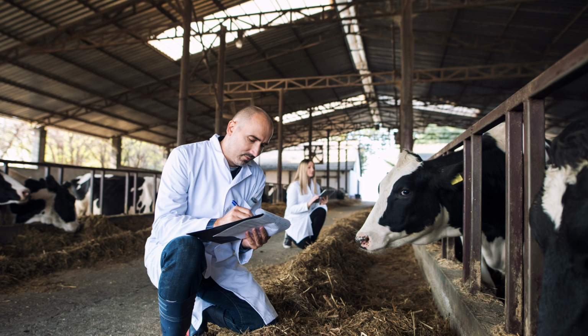I will share my screen again. So now we will look into some things to think about and examples for reading exercises for broth microdilution, which is of course also very important. If you are going to use broth microdilution, it's usually because you want to have a reference method.